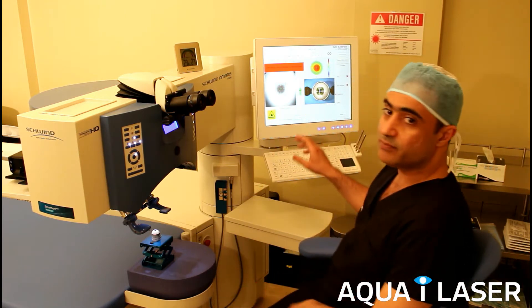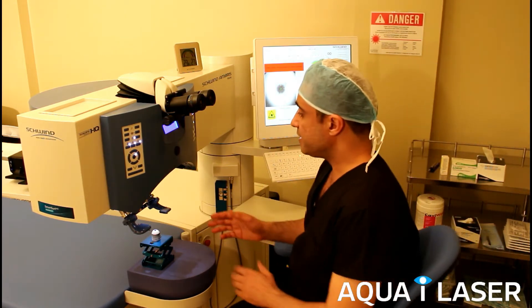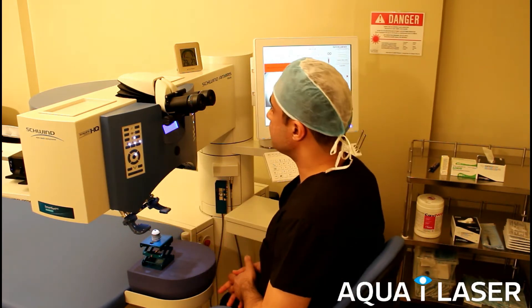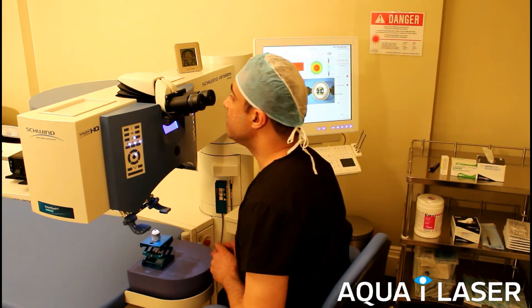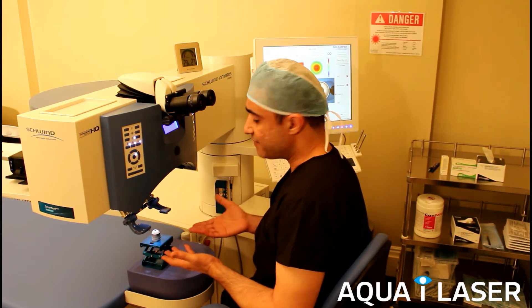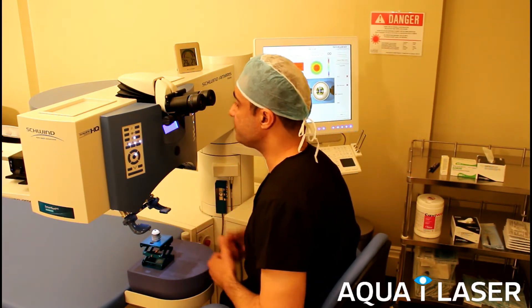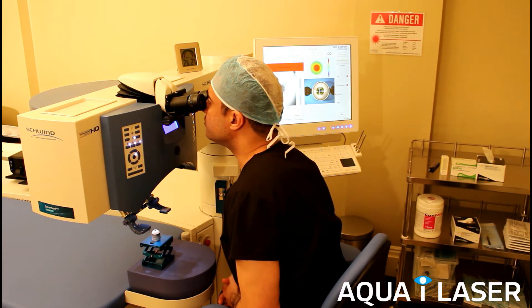We have the treatment plan already planned and the eye tracker and everything in place. We ask the patient to look at the green flashing light and then we start the treatment. I don't have to put my hands in the field because everything is tracked with the machine, and then we go with the laser treatment like that.